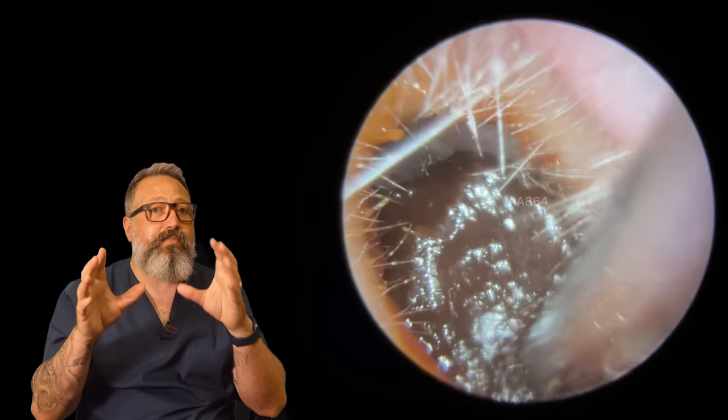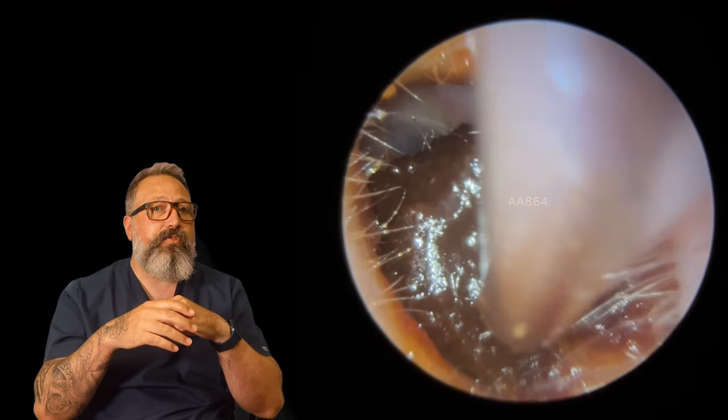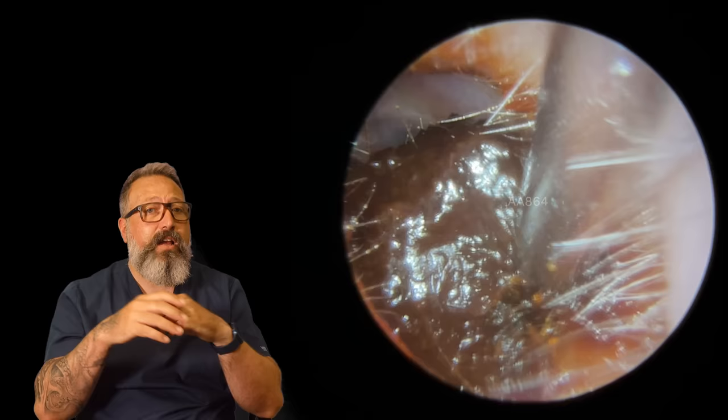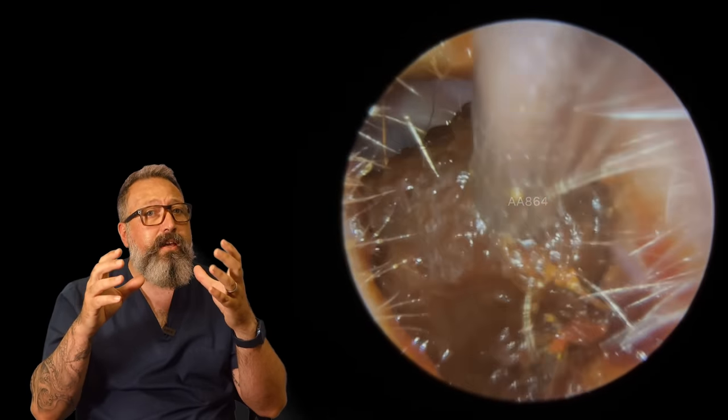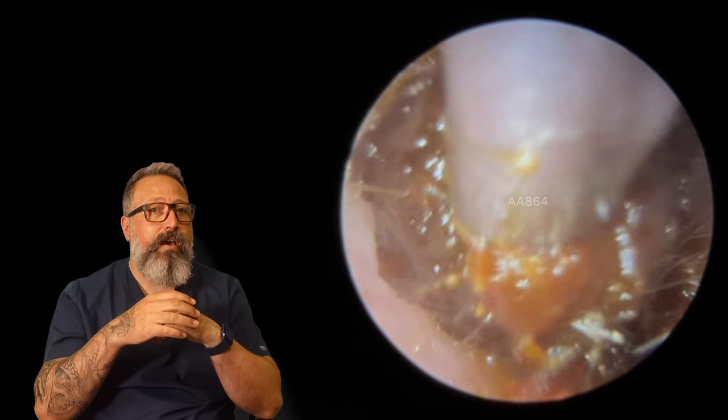The patient's other ear canal here you can see is pretty blocked up as well. This looks like a nice little plug to remove — if we can detach it from this canal wall, it's going to come out really, really easily. There we go, out that comes. We're giving it a little bit of a wiggle, and out that comes.